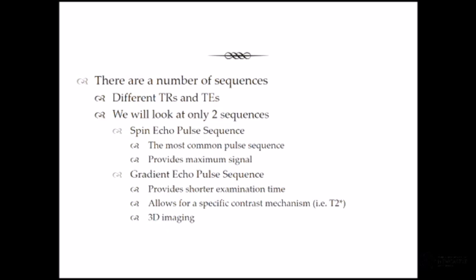We want to start thinking about doing gradient echo imaging so we can do those in breath hold sequences, even with really short imaging sequences, in 6 seconds, out to about 24 seconds. Okay? So that's where we start to think about opening up the armoury and saying, okay, we're going to go with gradient echo sequences if we want to do breath holds.